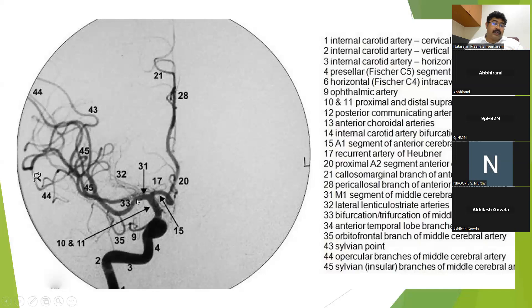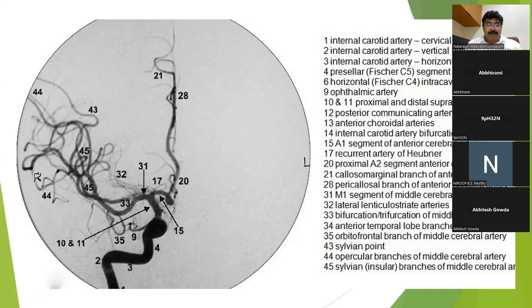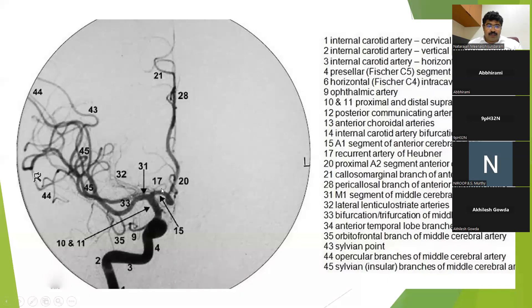The middle cerebral artery then divides into a superior trunk and an inferior trunk, which we will discuss when we discuss the middle cerebral artery. This is the recurrent artery of Heubner, which arises from the A1-ACA and usually arises distally and then courses proximal.